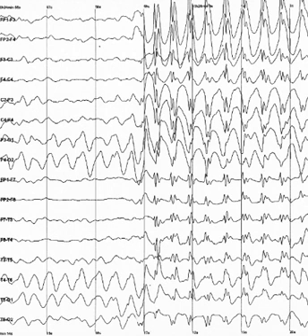The electrocorticographic signal is processed in the same manner as digital scalp EEG above, with a couple of caveats. ECoG is typically recorded at higher sampling rates than scalp EEG because of the requirements of the Nyquist theorem. The subdural signal is composed of a higher predominance of higher frequency components. Also, many of the artifacts that affect scalp EEG do not impact ECoG, and therefore display filtering is often not needed. A typical adult human EEG signal is about 10 microvolts to 100 microvolts in amplitude when measured from the scalp and is about 10 to 20 millivolts when measured from subdural electrodes.